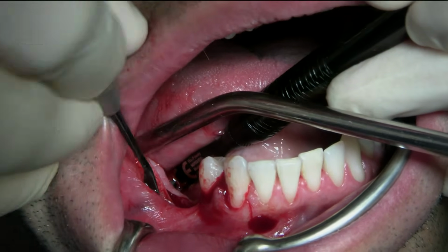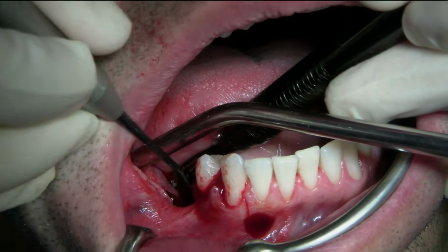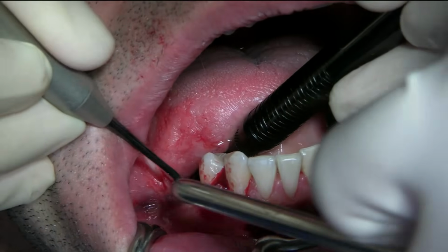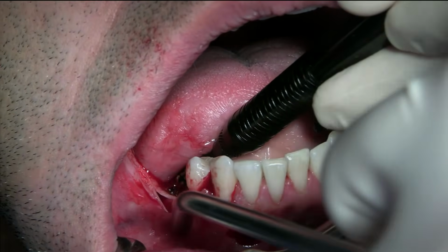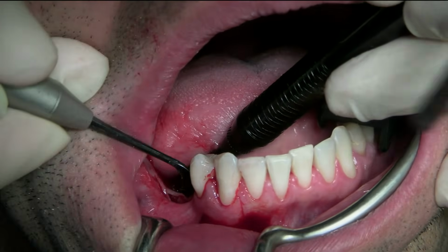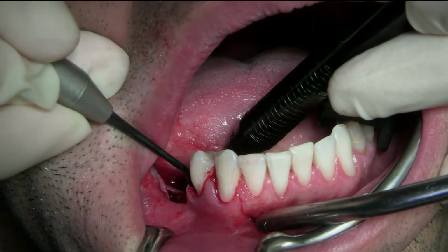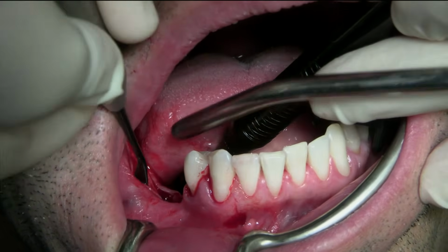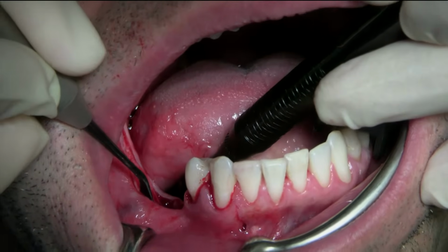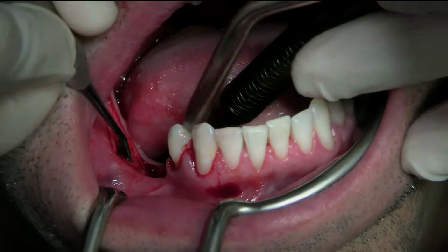Now I'm going buccal. Again, it needs to be full thickness. Suction here. Maybe ask Mariana. What would you like to see? Okay, suction there. I'm getting my buccal flap.